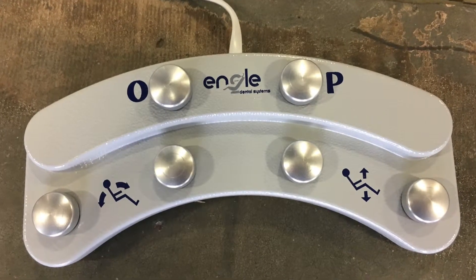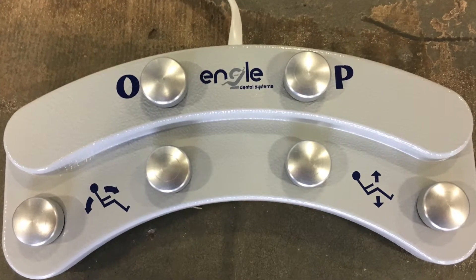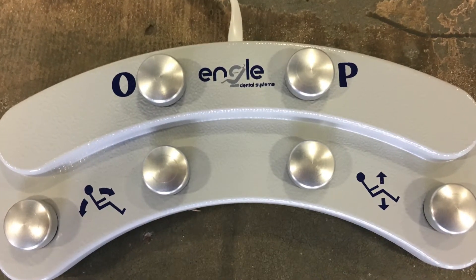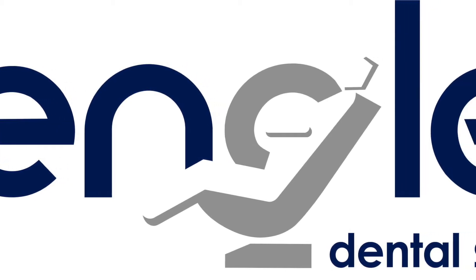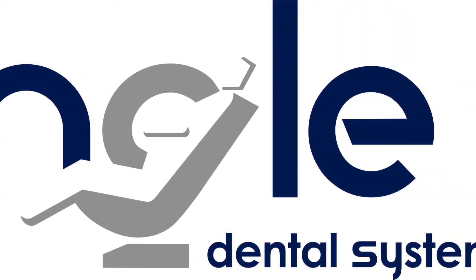The P button on the foot control will recall the last pre-programmed position pressed using the touchpad. The chair will remember your programmed positions even after loss of power and/or unplugging the chair from its electrical source.